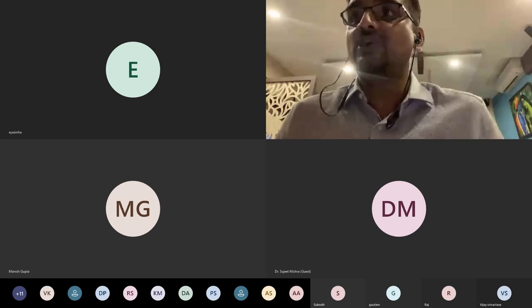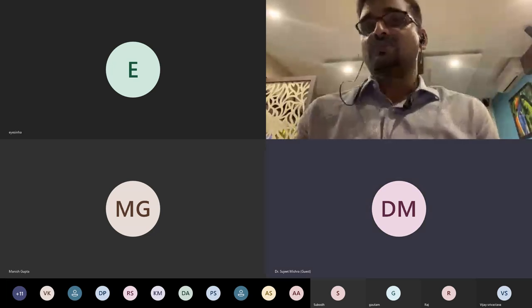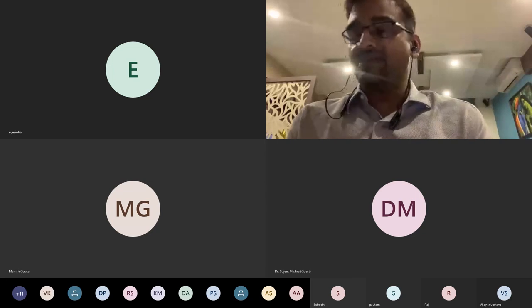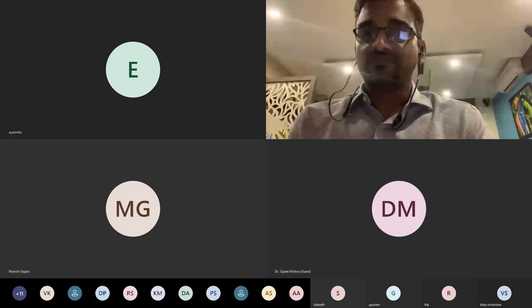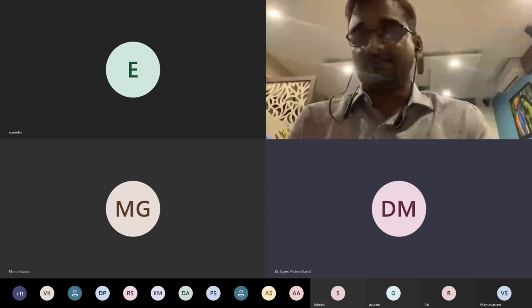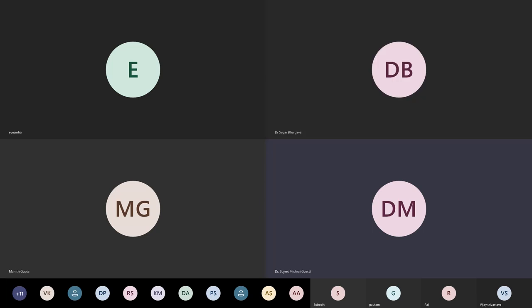The second issue with Hill RBF is that it's basically on a single machine right now, if I'm not wrong, the Lenstar, with one lens, I'm not sure. So that is also an issue with Hill RBF. Only time will tell whether it overtakes all the other formulas. But as of now, its performance is probably almost the same as Barrett Universal 2. Yeah, that is what I said. Dr. Sagar very rightly pointed it out. I omitted many things because of lack of time. The power range is mentioned for Hill RBF, that right now it is available up to this range of power only. So you rightly said, as we grow, the database will increase and we will be able to cater to larger varieties of eyes. So it is open-ended.